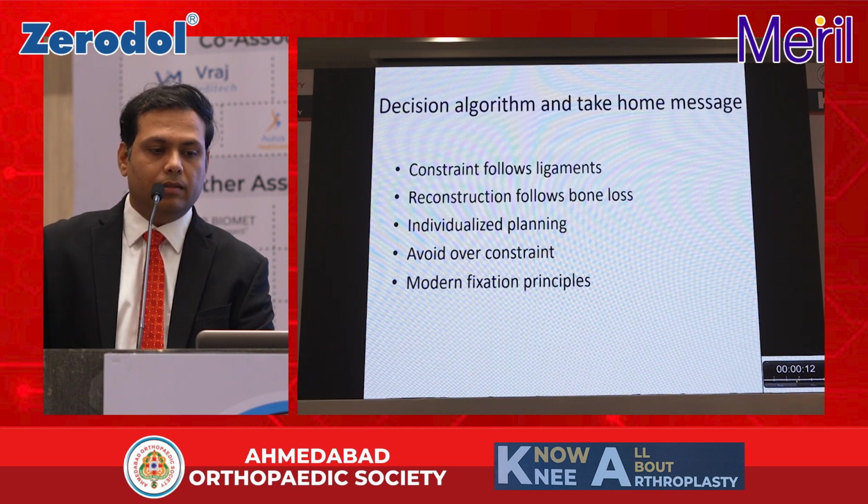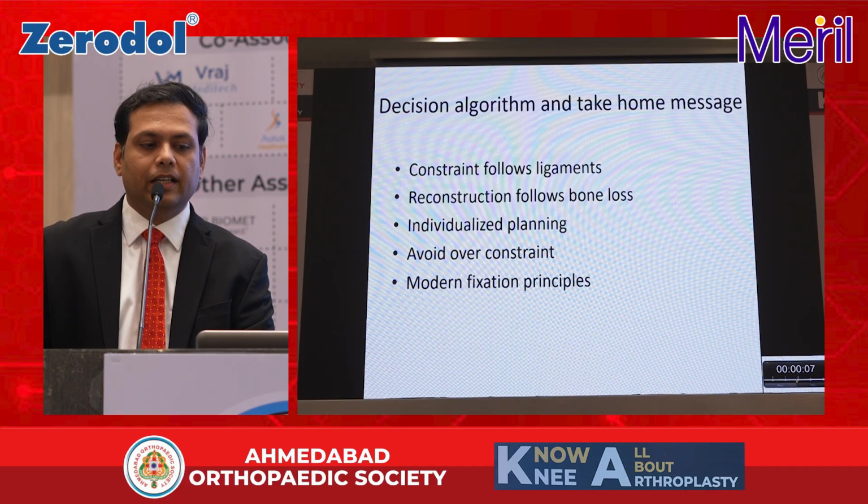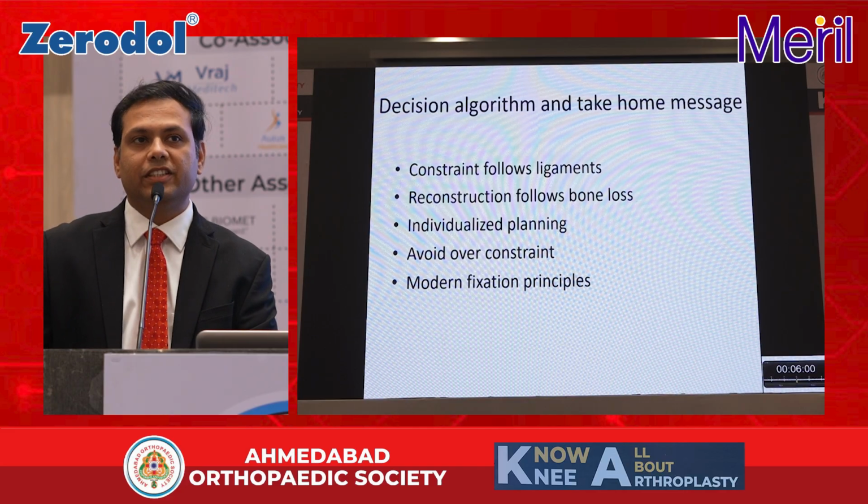So, just a decision algorithm and take-home message. Constraint follows the ligaments. Reconstruction follows bone loss. Individualized planning is always necessary. Always avoid over-constraint and always follow all modern fixation principles.